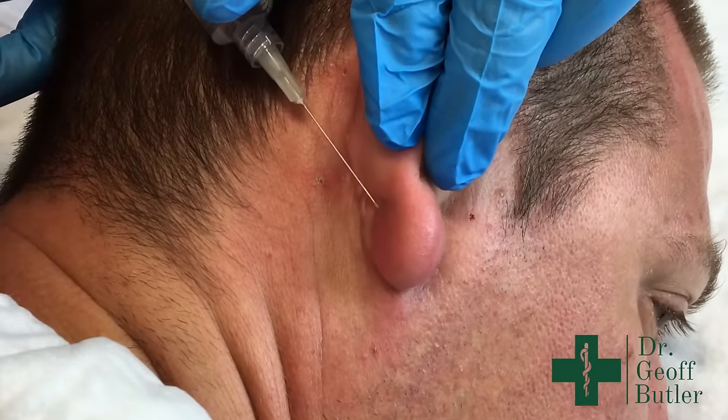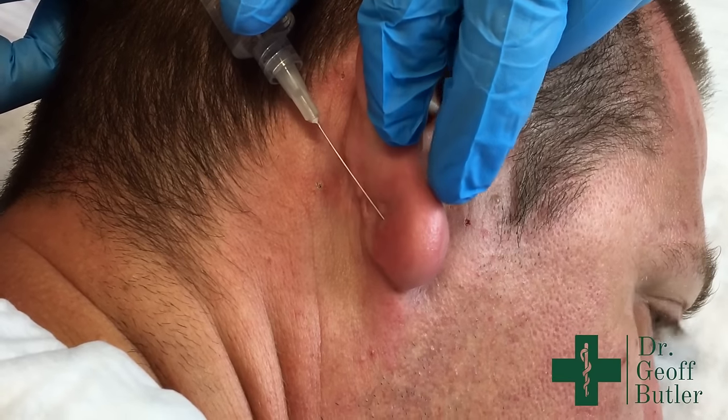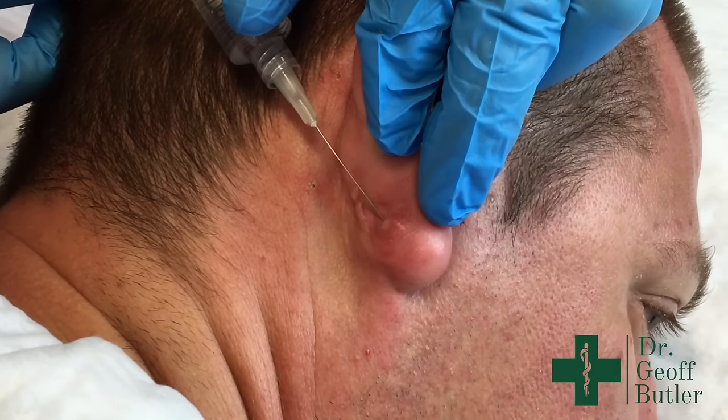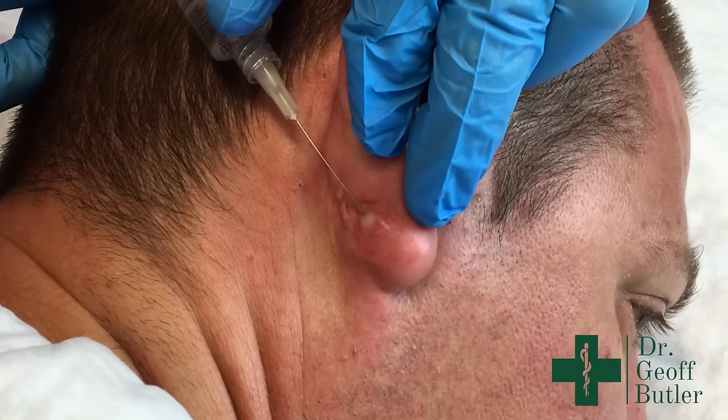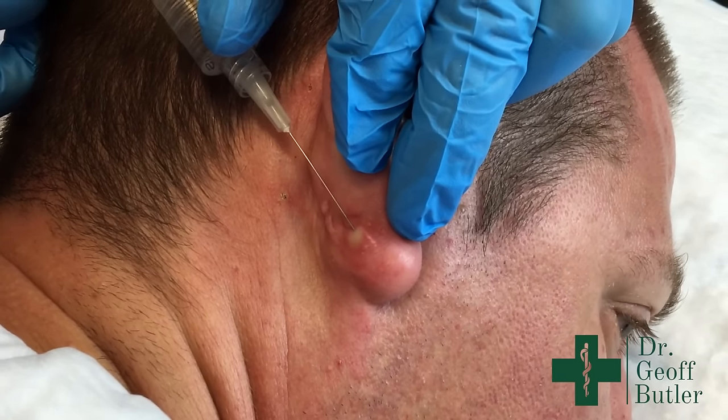Craig, you're going to feel a bit of a poke here — or maybe you won't. He feels some pressure, which is expected because we're putting more fluid into a space. You can see that blanch as the blood vessels collapse a little bit.